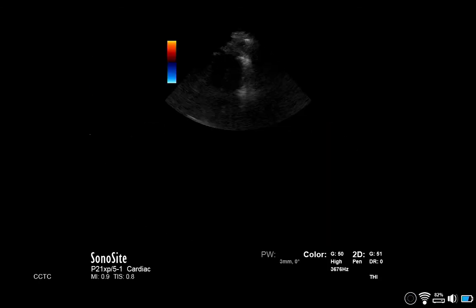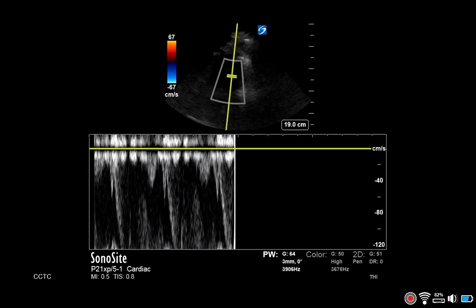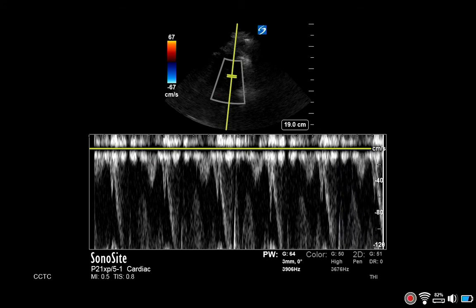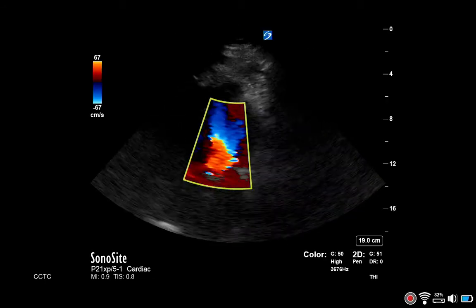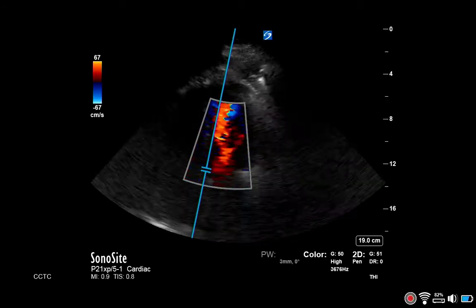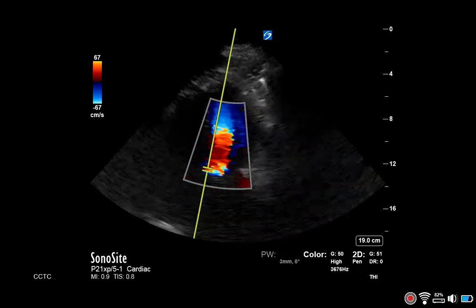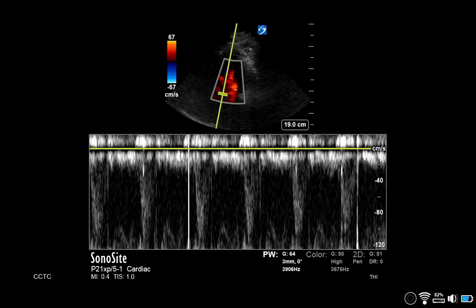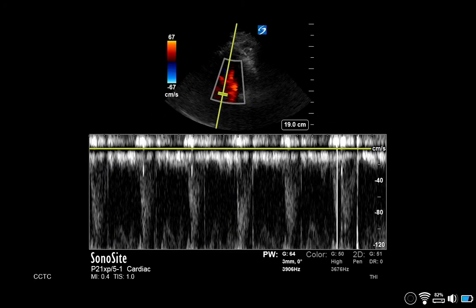Enable pulse wave and begin in the mid cavity, looking for aliasing. Next, move to the LVOT and position the gate roughly where you would measure an LVOT VTI, once again looking for aliasing, which is seen below.